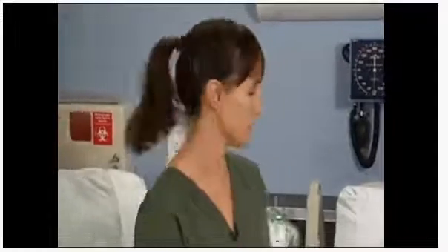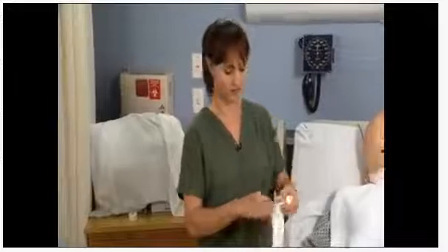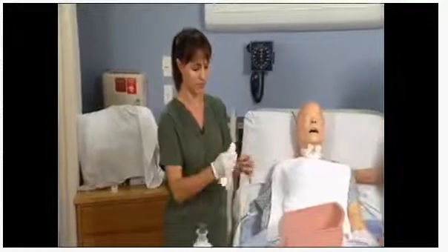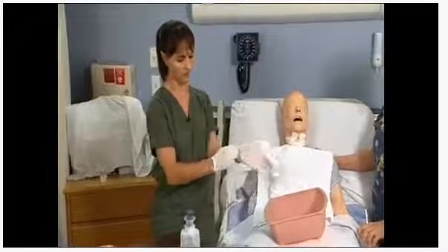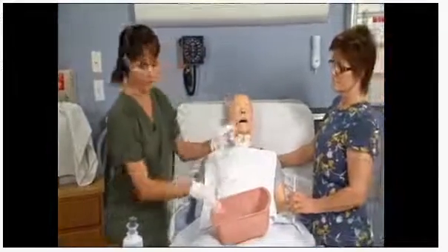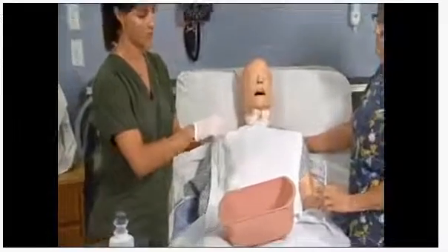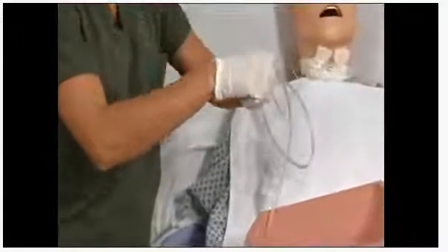Okay, once I've gotten my tape ready, I want to go ahead and apply my gloves. And you only need to put on clean gloves. This is not a sterile technique. Now I'm going to go ahead and get my NG tube and I'm going to go ahead and lubricate it. When you lubricate it, make sure you put as much as you can on it because it will help it go down a little bit easier.